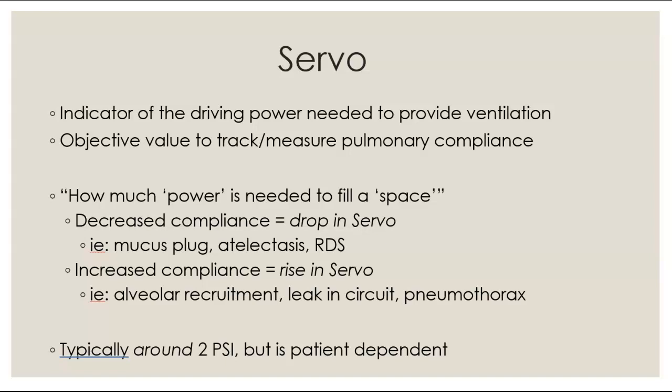Maybe there's a leak in the circuit. Maybe we have a pneumothorax. For example, there was one time I had a baby on the jet for a while, and all of a sudden my servo shot up to 5 out of nowhere. It's because I had a leak where my flow interrupter box was. My servo was just trying to use driving power to fill up the whole room because there was a leak in my circuit.